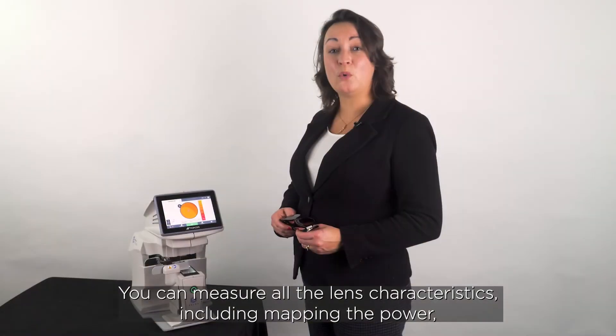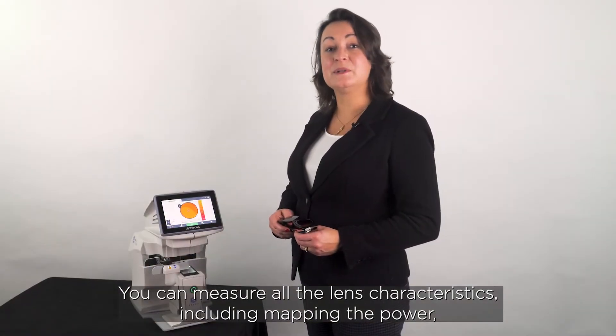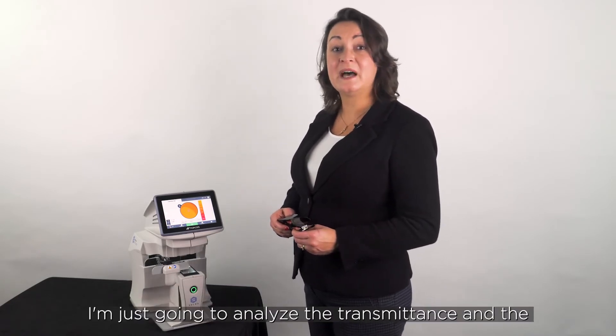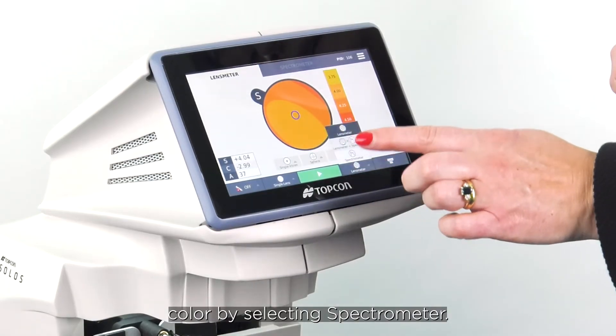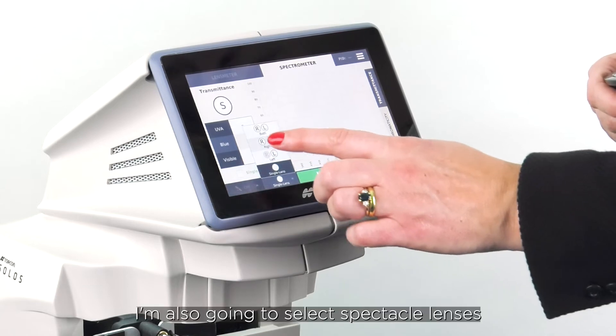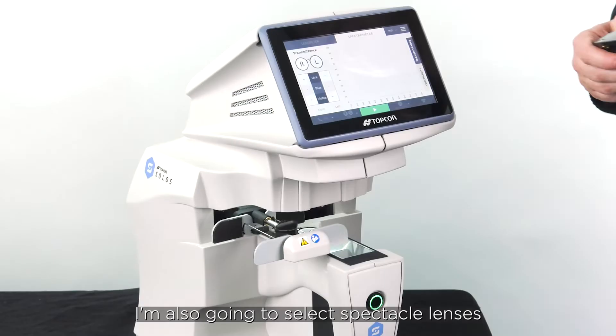You can measure all the lens characteristics, including mapping the power, but on this occasion I'm just going to analyze the transmittance and the color by selecting spectrometer. I'm also going to select spectacle lenses.